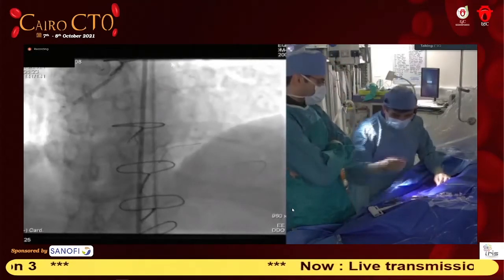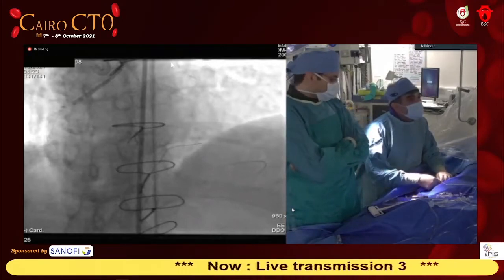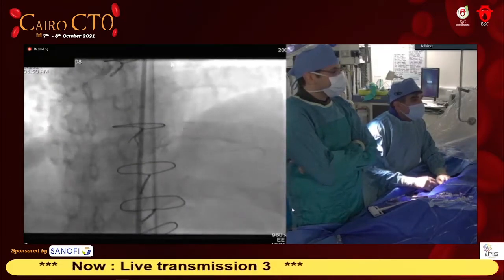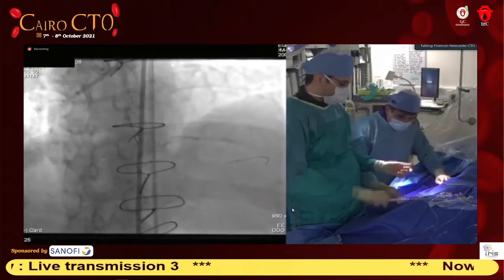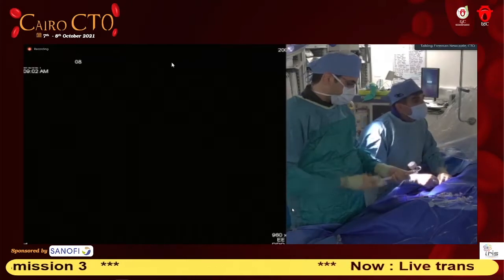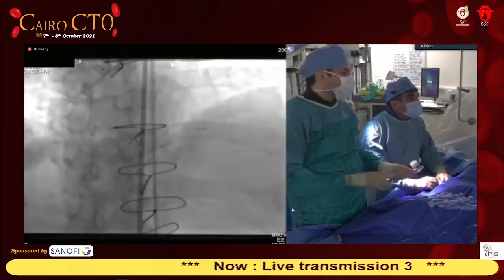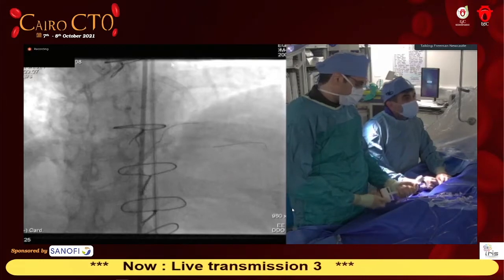Okay. I would really go after the bend with a longer stent. Ready? To go after the bend with a long stent that will cover the whole area. Definitely. Just wanted to get this as a kind of fused balloon. You're just going to have to do it slowly. The size of the stent. 3.0, 10, 12. Okay. 16 and down. Store that for me.